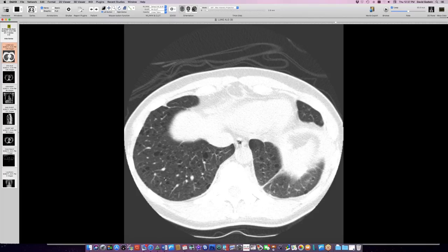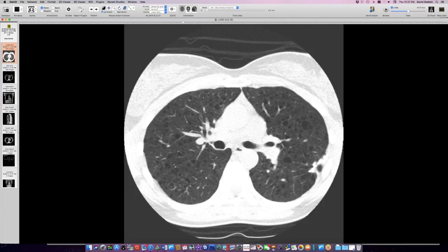More than a decade after her original presentation, she has all these thin-walled cysts throughout her lungs — very thin walls, nothing inside the cysts, no distortion, well represented at the bases. This is documented lymphangioleiomyomatosis, presenting with chylothorax. The dilated lymphatics in the upper abdomen were visible on CT as the low-attenuation lesions.